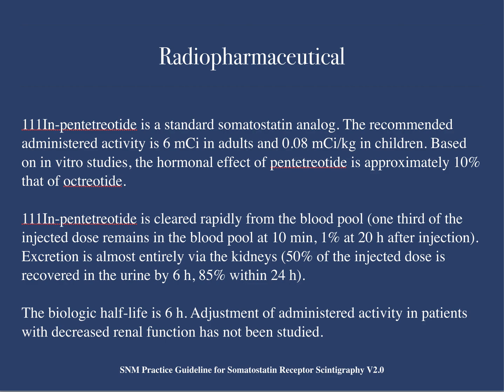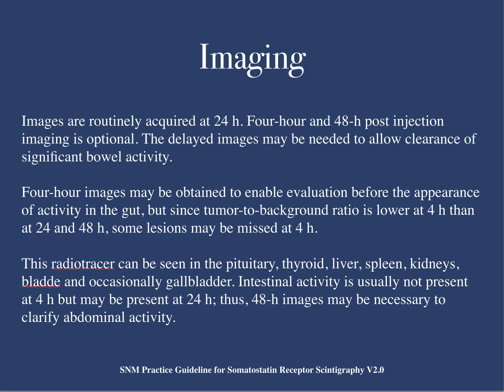The biologic half-life for the molecule is about 6 hours. Imaging is typically performed 24 hours after the injection. However, 4 hours can be performed as well if we're quite sure that we know what we're looking at, and 48 hours is always the answer in nuclear medicine. Whenever we're given a chance to do a delayed image, we always do a delayed image.